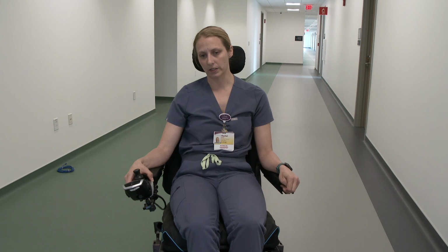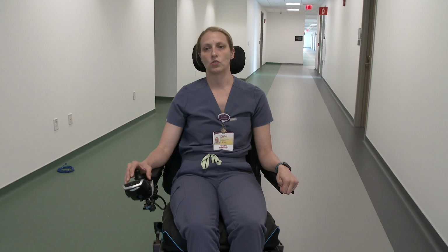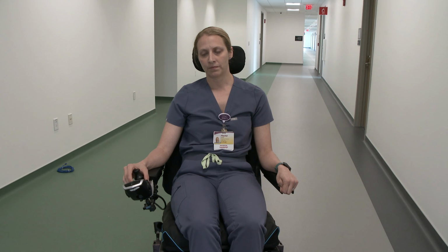For someone with a progressive diagnosis where you're changing different types of joysticks and changing how the chair moves, it can be something to consider that while someone may have been a very good joystick driver, when they switch to something like sip and puff, it may have a pretty significant learning curve because it's a different input style, it drives differently, you have to use different switches and methods of accessing it. Not that it's not possible, but it definitely takes more thought and attention.